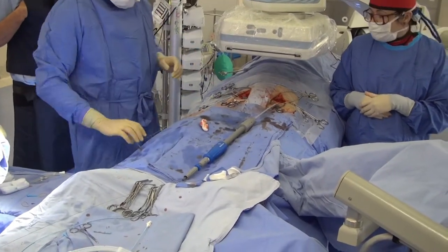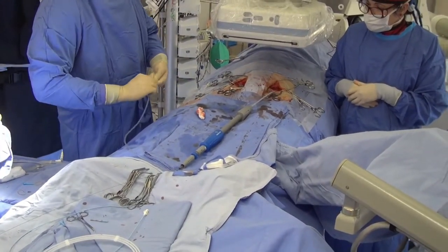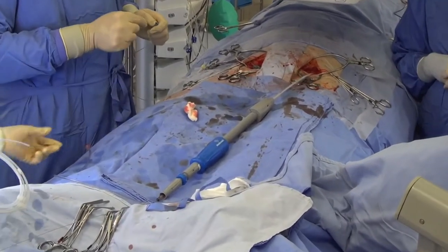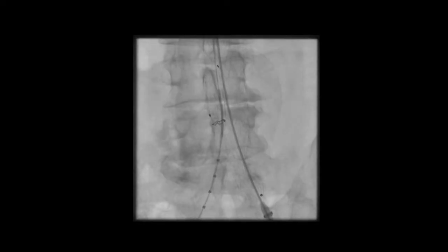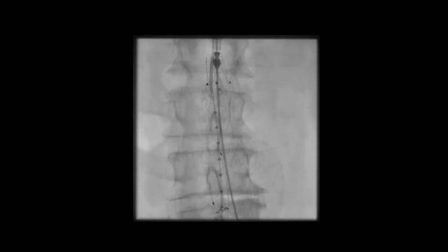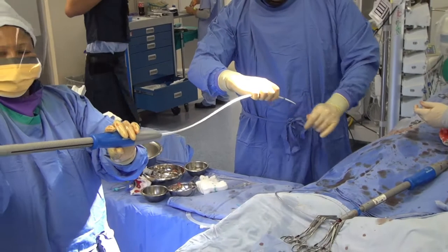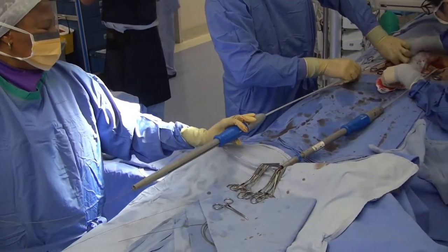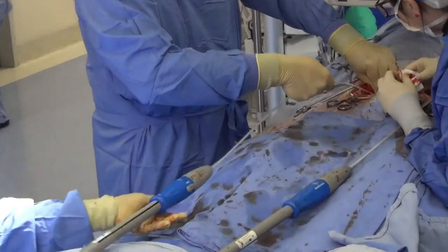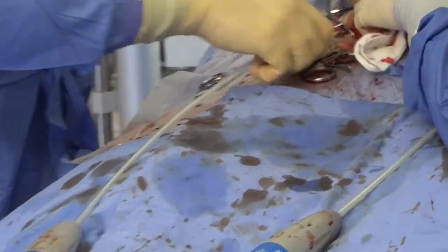The softer wire is placed on the contralateral side to cannulate the contralateral limb of the main stent prosthesis. This can be quite cumbersome, but in this specific case it was relatively straightforward due to the favorable anatomy. You can see the pigtail catheter being advanced into the main body. A stiff wire is advanced through the contralateral side before the contralateral limb is inserted via the femoral artery and iliac arteries into the main stent prosthesis.